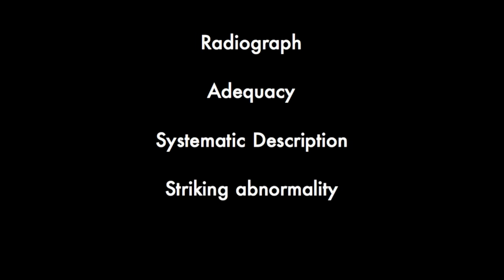However, an alternative is to describe right away the most striking abnormality. This is risky as it commits you to things early on in your observation and description. However, some examiners prefer you to do this in order for you to get through a number of radiographs quite quickly.